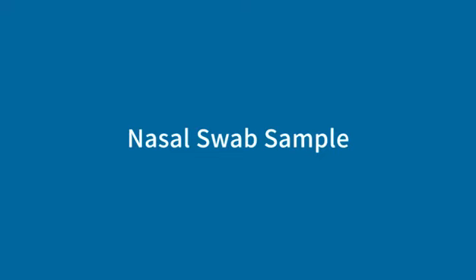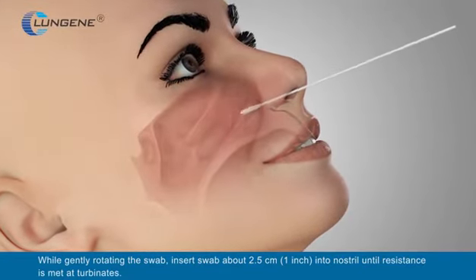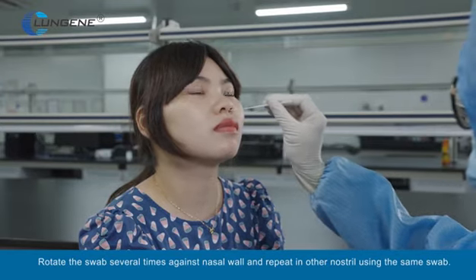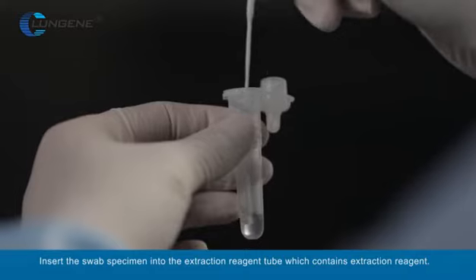Nasal swab sample. While gently rotating the swab, insert swab about 2.5 centimeters (1 inch) into nostril until resistance is met at the turbinates. Rotate the swab several times against the nasal wall and repeat in the other nostril using the same swab. Insert the swab specimen into the extraction tube, which contains extraction reagent.